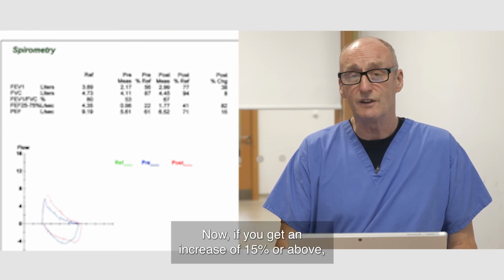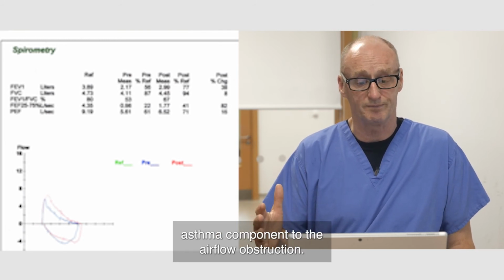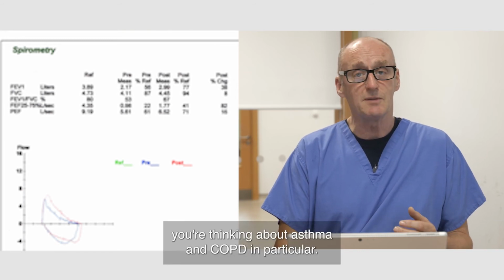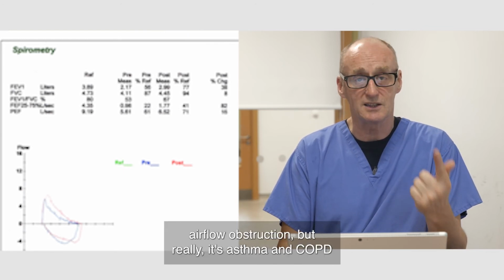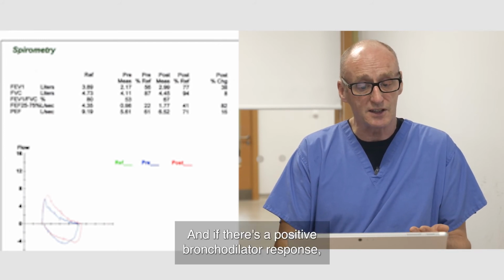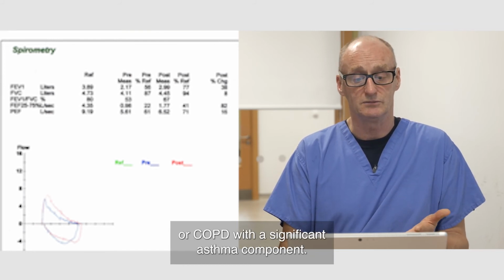Now, if you get an increase of 15% or above, that usually indicates that there's a significant asthma component to the airflow obstruction. So when you get that kind of airflow obstruction, you're thinking about asthma and COPD in particular. There are some other disorders that will give you airflow obstruction, but really it's asthma and COPD in the majority of people. And if there's a positive bronchodilator response, as there is here, then it's either pure asthma or COPD with a significant asthma component.